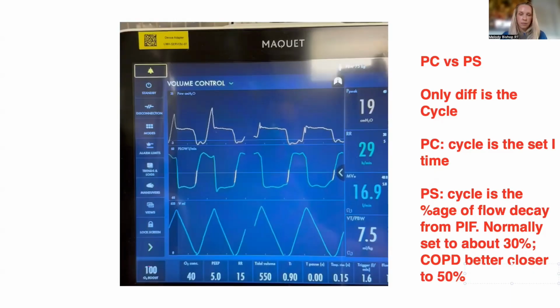But the problem in emphysema is if you set the cycle decay too low, remember, since the lung is so compliant, meaning it takes a very small pressure differential to generate flow, you can theoretically trap the patient in inspiration forever, because they will never be able to decay that flow to that number of 10% or something, right? Because if their peak inspiratory flow is 100, they need to get to 10. But in a patient with emphysema, if you just have a tiny bit of pressure differential, you're going to generate a flow because the compliance is so good. Good in this situation means not good, right? And as you mentioned, you're going to lead to a cycling dyssynchrony because the patient is going to try to be pushing out and they're not going to be able to flip the ventilator.